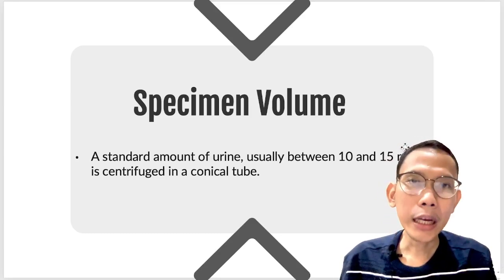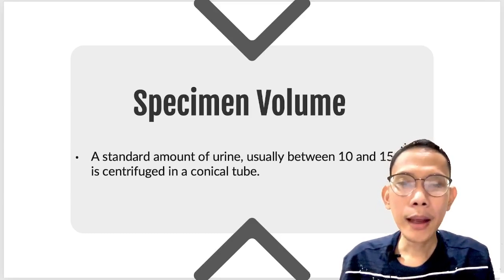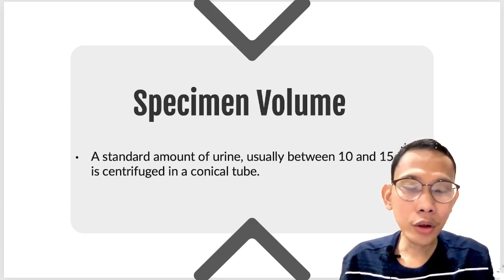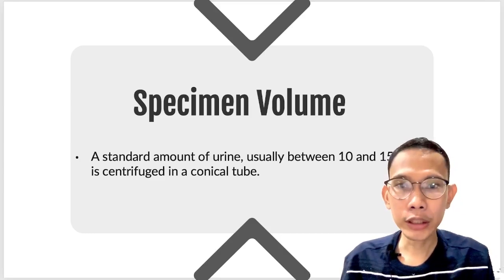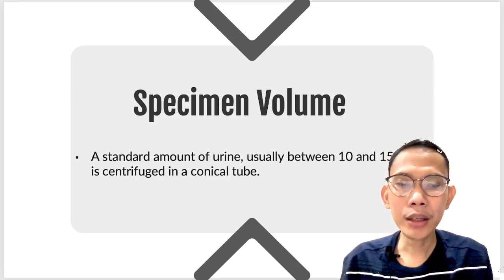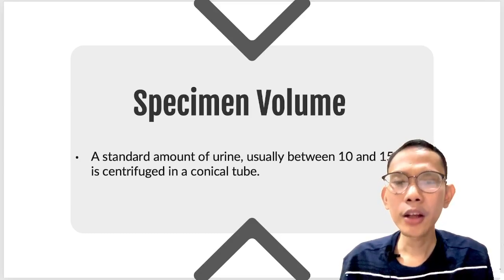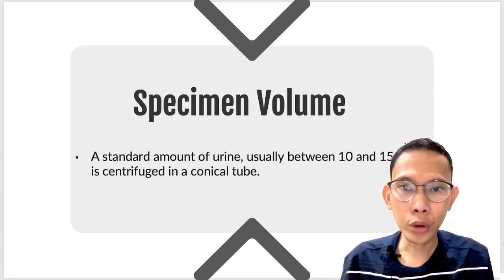Again, these guidelines are based on the book, but that will also depend on the hospital protocol if you really need to report it. But ideally, ako personally, when I receive a sample of less than 12 ml, less than 10 ml, I always ask for a repeat collection.